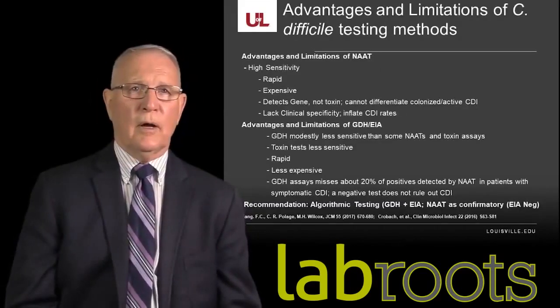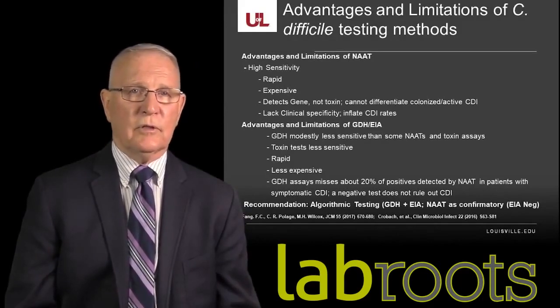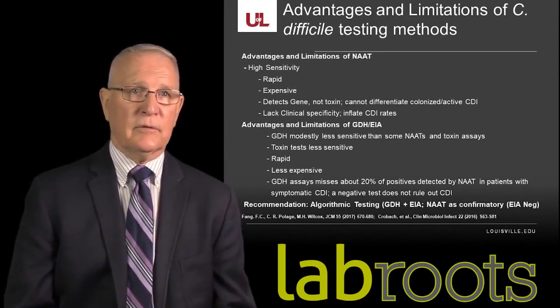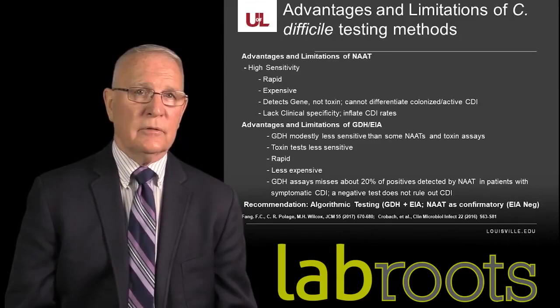So before we summarize what we've been talking about today, I'd like to go over for a few moments the advantages and limitations, or strengths and weaknesses, of the current Clostridium testing methods. And I'll start with the nucleic acid test.